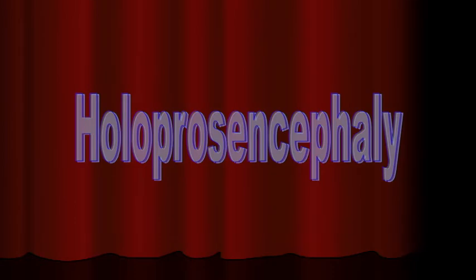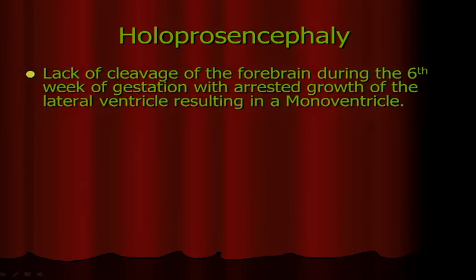How do you tell semilobar? It's between the two. It's got a little bit of differentiation. It's a little bit tougher. You have to show a picture of the thalami to see if they're fused or not, or else it could be either. But if you have maybe midline separation in part of the brain, but not all the way, that would be semilobar.